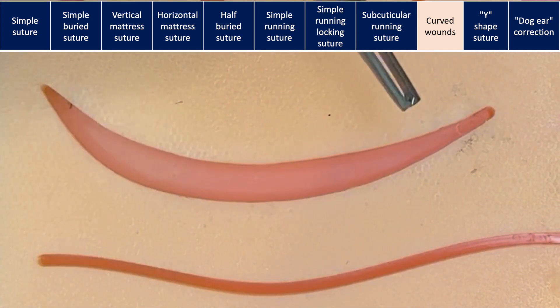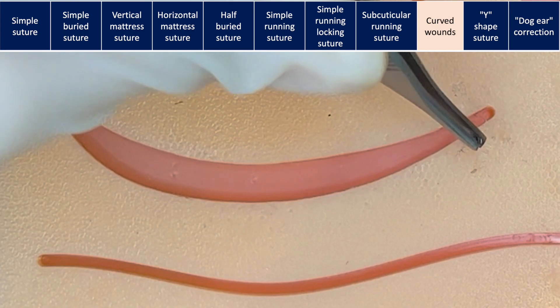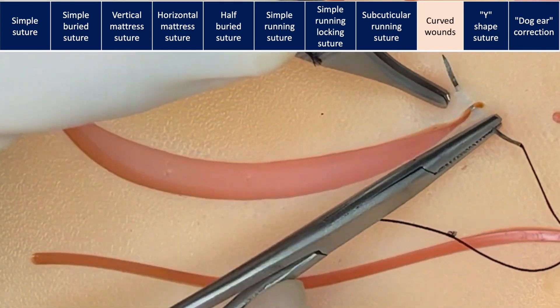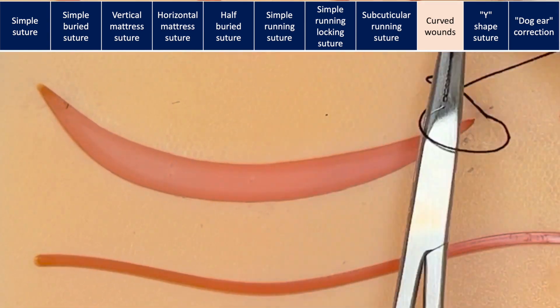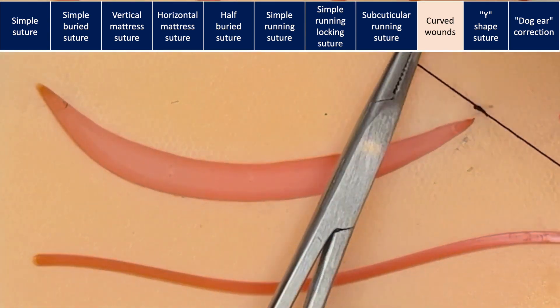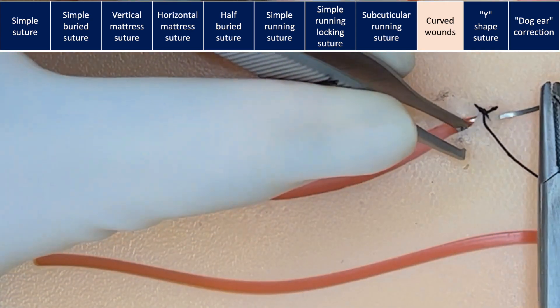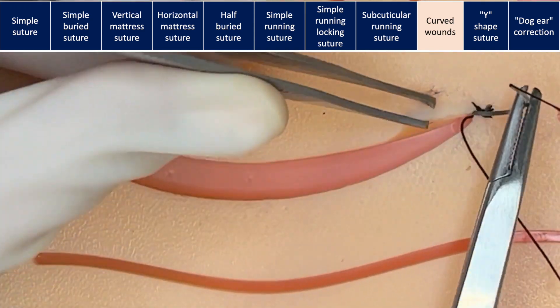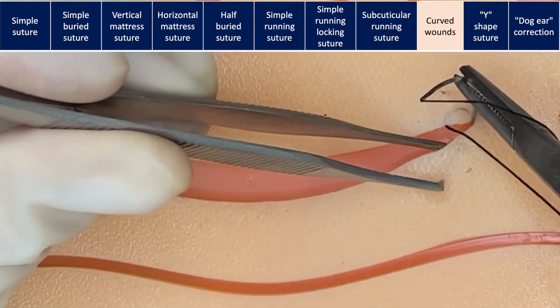Now we're going to suture this curved wound. As you can see, the length of the inner edge is shorter than the length of the outer edge. I'm going to start with the knot on the outside of the wound, but you can also start with a buried knot. If the knot is outside, you should enter the skin and start in the dermal area. The most important aspect of curved wounds is to compensate the skin to prevent a dog ear.